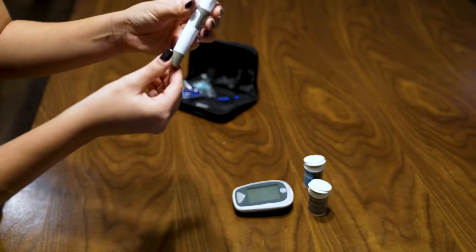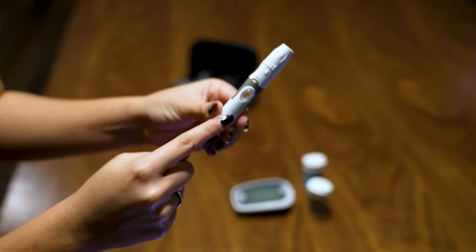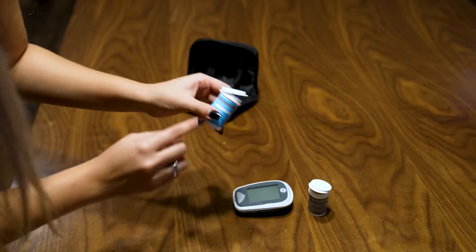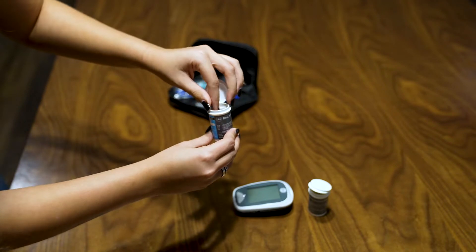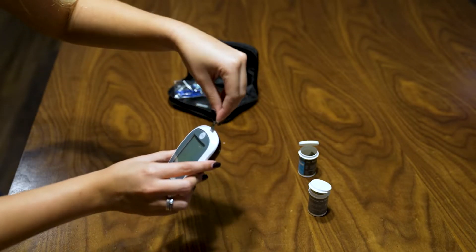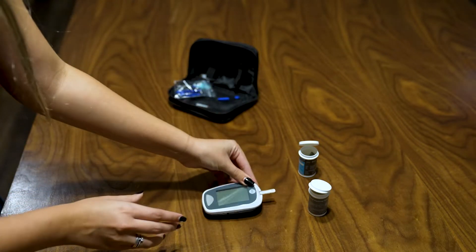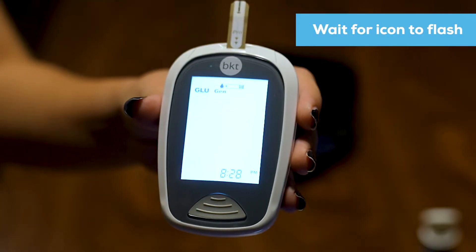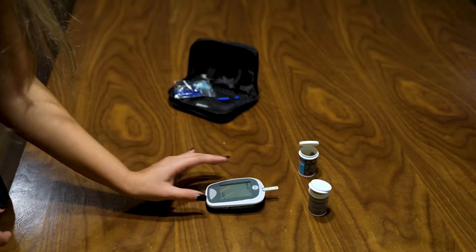And then I'm going to pull this back. I see the orange, so it's ready to fire. Put it to this side. Then I'm going to go into the vial, get the glucose test strip, and put it into the meter. Wait for the check — it's ready. The icon is flashing, so it's ready for the test.